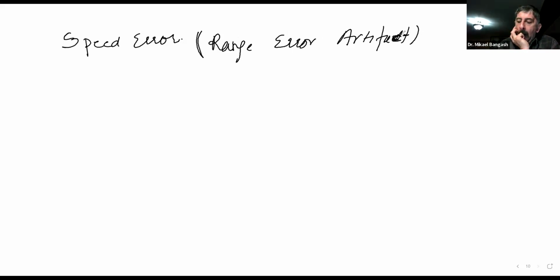Now, guys, when we say speed error, there was an assumption talking about the speed of sound in soft tissue.